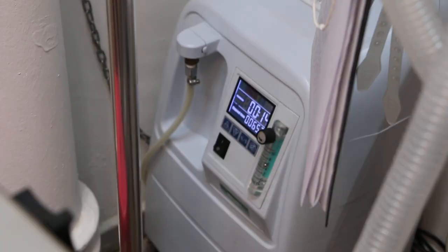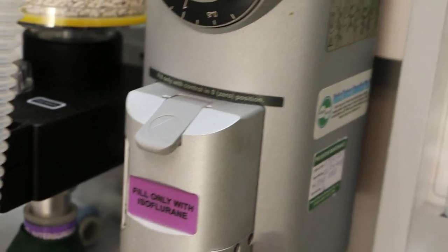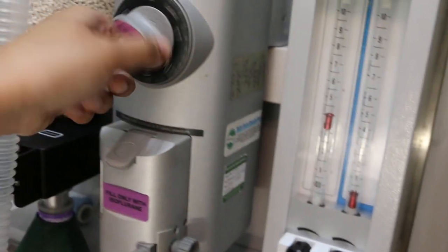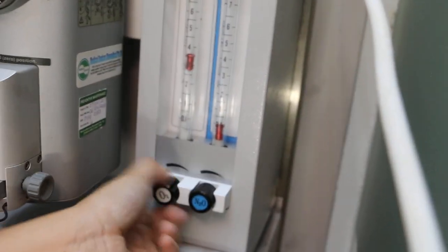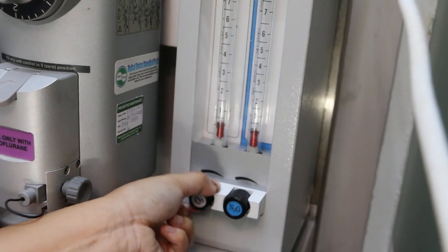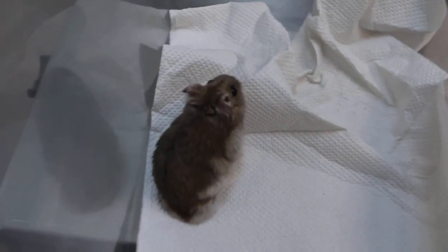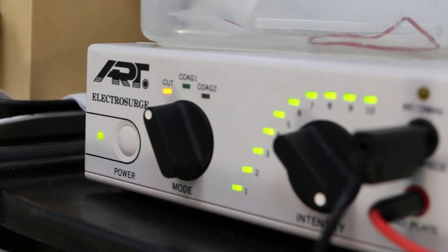Oxygen only and isoflurane gas. The whole process is actually 3 minutes preparation for it. That was 5% and the flow rate was more than 4 liters per minute. And then switch off the oxygen generator. And the hamster is good to go home. Today you can see he's back to normal. No need to worry about anesthetic death if we are good and fast. Electrosurgery is important because of the ease of doing it.